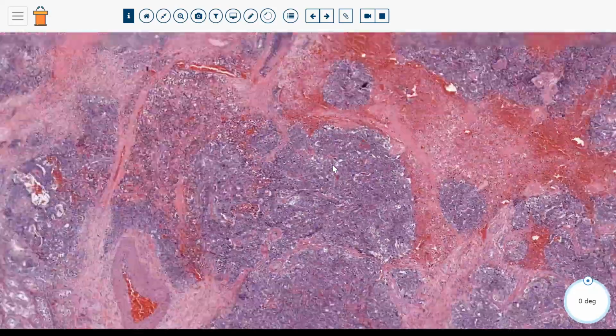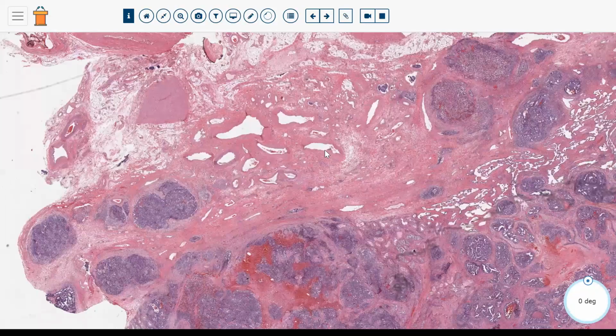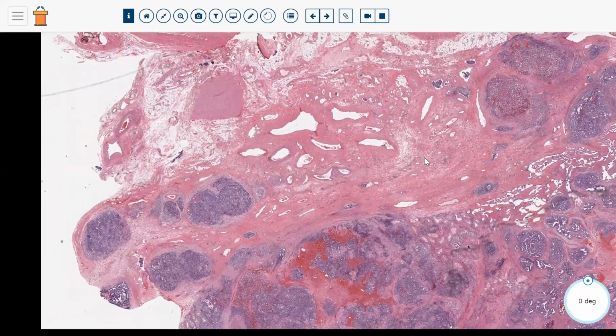And so let's talk a little bit about the staging in this particular case. If we go to low magnification again, you can see there are these big round structures that are going into the testicular hilar tissue there. And I think actually in this particular case, almost all of these big rounded structures in the hilar tissue represent lymphovascular invasion, which is a way to reach the pT2 stage in testicular germ cell tumors. So some of these are probably actually quite large vessels that are entirely obliterated by the tumor.